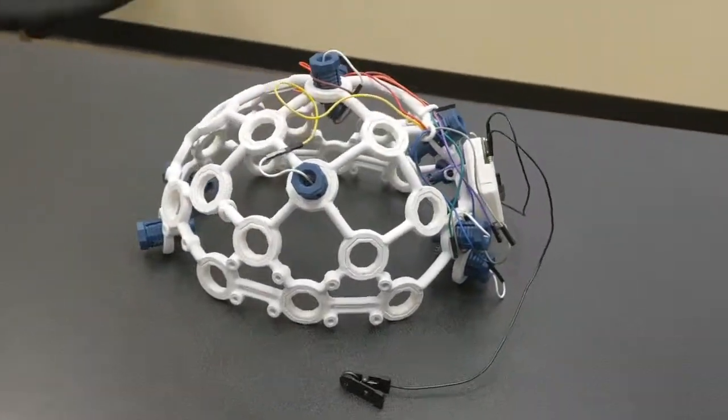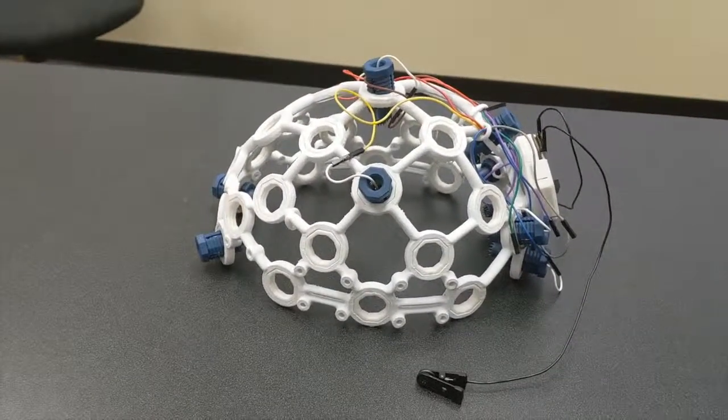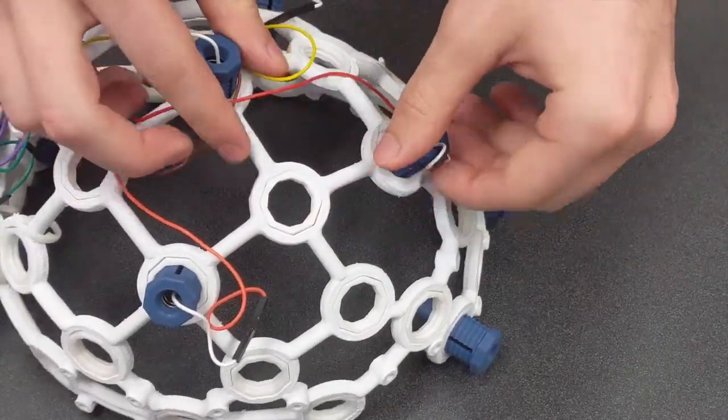The Cortex is a 3D printed cap that allows for electrodes with tiny cones to be screwed in tightly to the user's head.